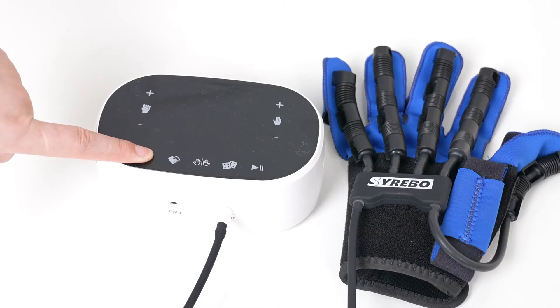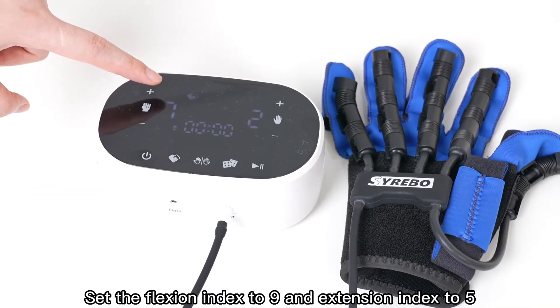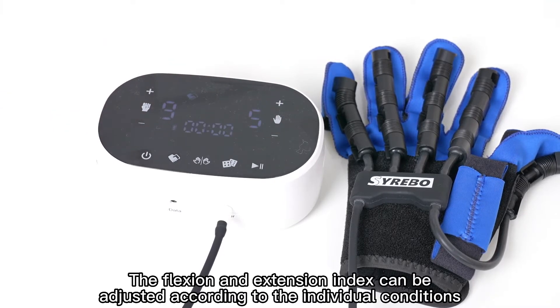Select the Passive Mode. Set the Flexion Index to 9 and Extension Index to 5. The Flexion and Extension Index can be adjusted according to individual conditions.